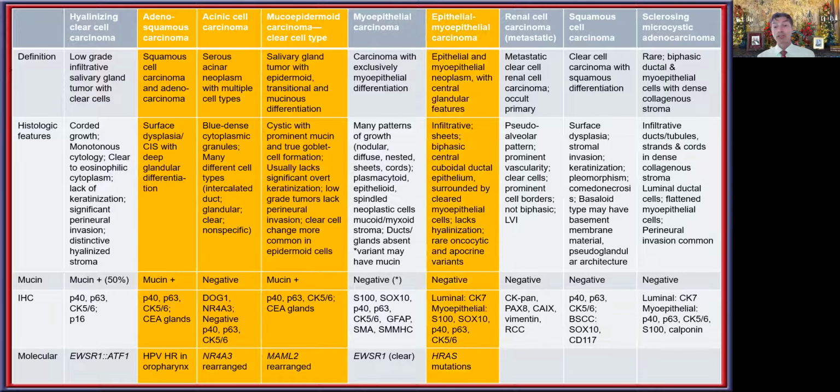So here is an example of a myoepithelial carcinoma, I think, with a very heavy stromal hyalinization. In this example with remarkable clear cells, again, it's going to fit into any one of the tumor categories that I've just described. An infiltrative architecture, kind of a nested trabecular or even cord-like pattern can be seen. Other areas here show a very well developed myxoid stromal component in a nested architecture, another area showing nests and cords separated out by the stromal myxoid background.